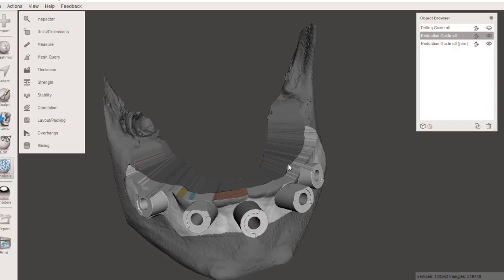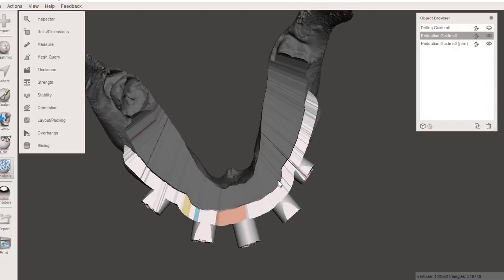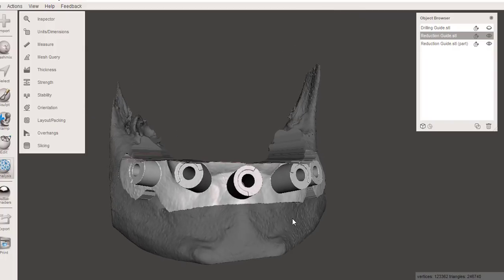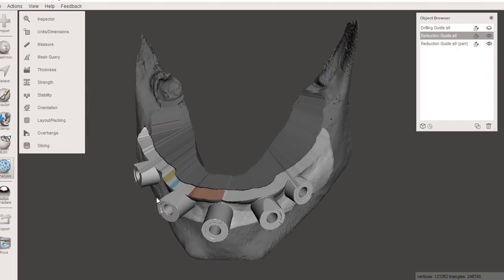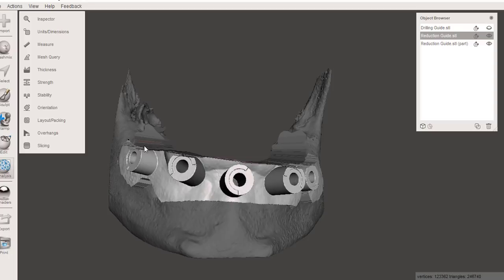You'll take this guide, which is going to fit really precisely. You'll be amazed at how well this just pops in, and there's no question about where this thing fits. It's not sloppy. You're not wondering if you're in the right position. There's only one spot that it can go. You'll drop this in against the jaw, trim it down anywhere you need to if you feel like the contour is excessive, and you'll just reduce the jaw down to the level of flat with this guide.